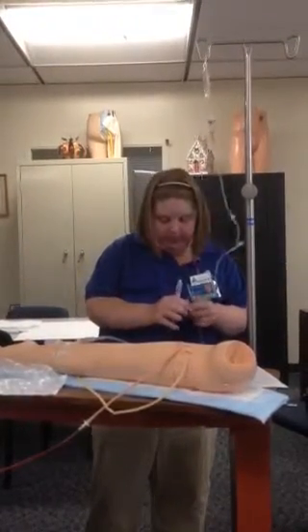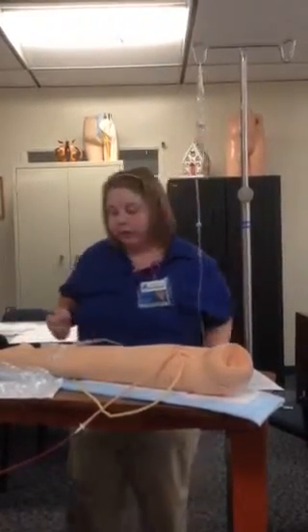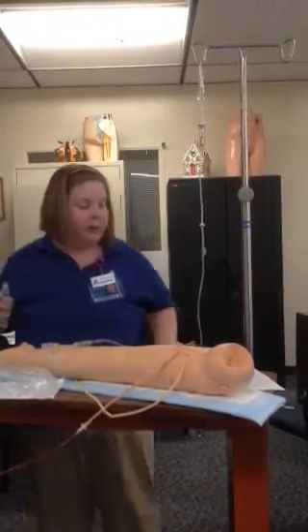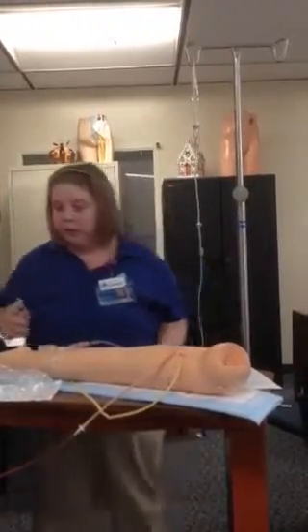I would clamp this off, and I would have labeled my tubing with my date, the time, and my initials. I'm clamping this off even though it's infused. I would put a fresh alligator clamp on there because it's good for 24 hours.